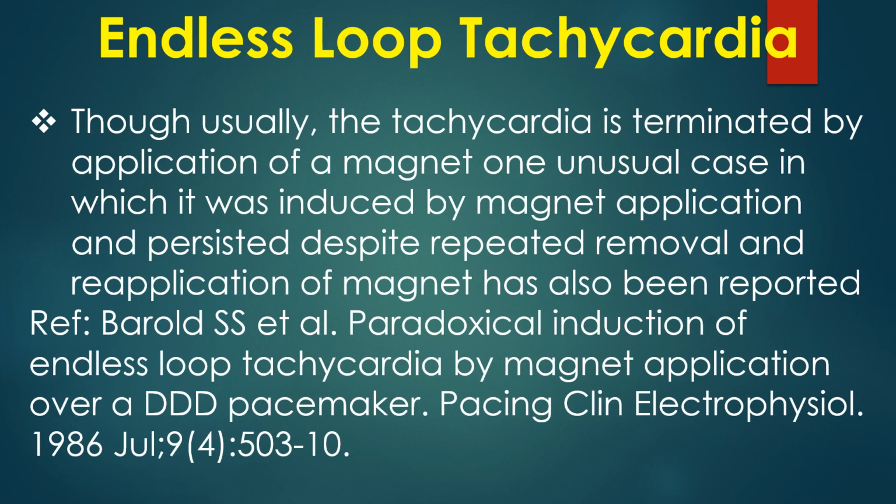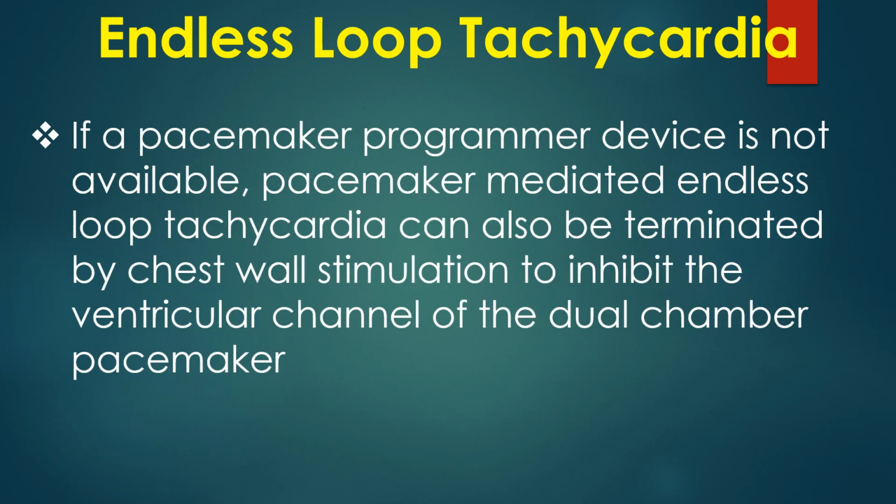Though usually the tachycardia is terminated by application of a magnet, one unusual case in which it was induced by magnet application and persisted despite repeated removal and reapplication of the magnet has also been reported. If a pacemaker programmer device is not available, pacemaker-mediated endless loop tachycardia can also be terminated by chest wall stimulation to inhibit the ventricular channel of the dual chamber pacemaker.